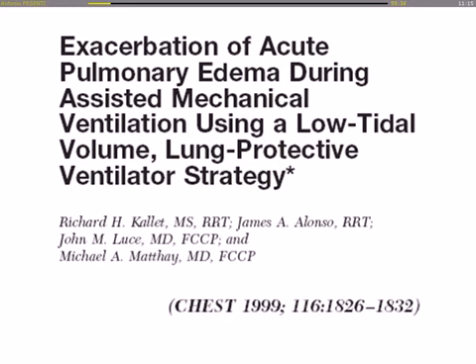These investigators reported that when patients were ventilated in assist control with low tidal volumes, some of them developed acute pulmonary edema. Low tidal volume, in general, is very good, much better than 12 milliliters per kilo. But if the small tidal volume is coupled with high ventilatory drive, the patient wants to breathe fast and deep.